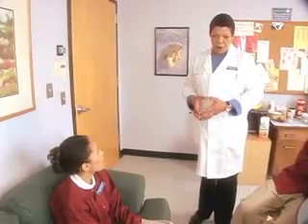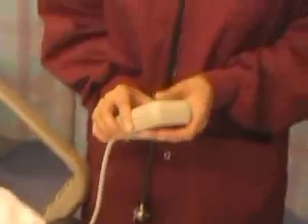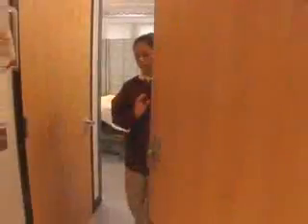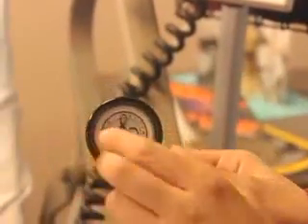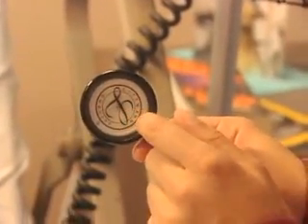Now, if you find this is a problem, try making sure the room is quiet. And check your equipment and connections. Check your stethoscope for the correct positioning of the head if it's a dual head, so the sound is being conducted through the bell or diaphragm, depending on the site you're using, of course.